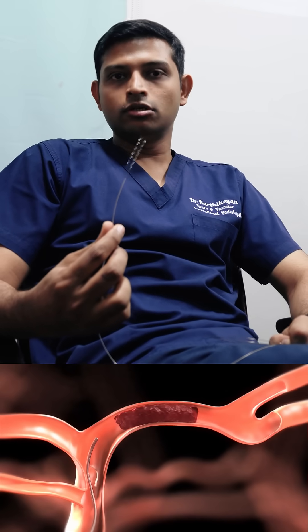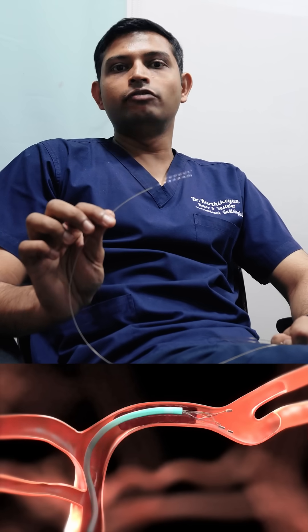How do we use these devices? We go either from your arm or from your thighs and take up multiple tubes to reach up to the clot site. Then we put this device across the clot and leave it for a few minutes, and then the clot gets engaged into this device and then we pull it out.